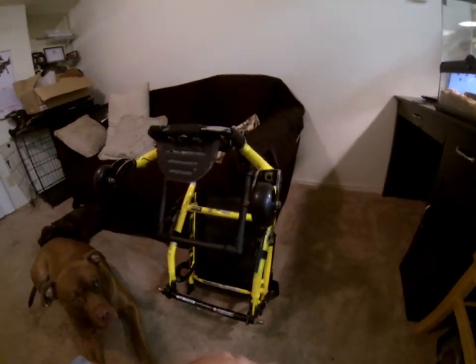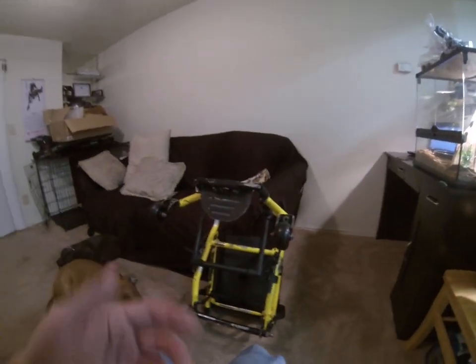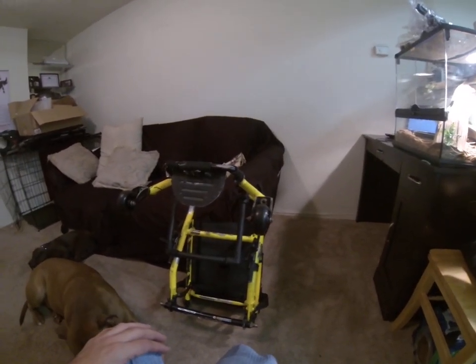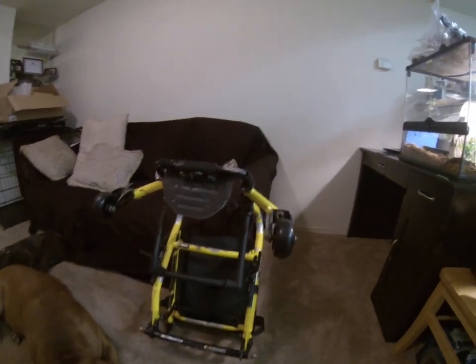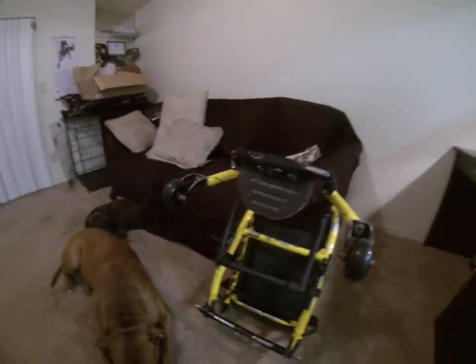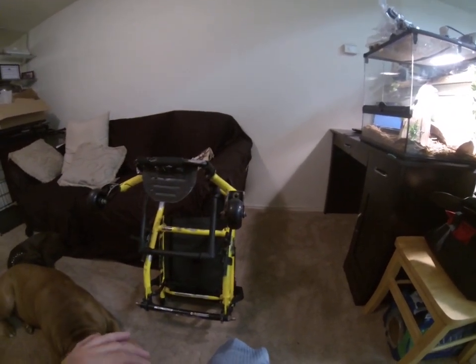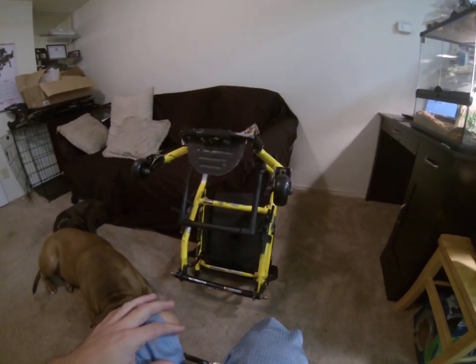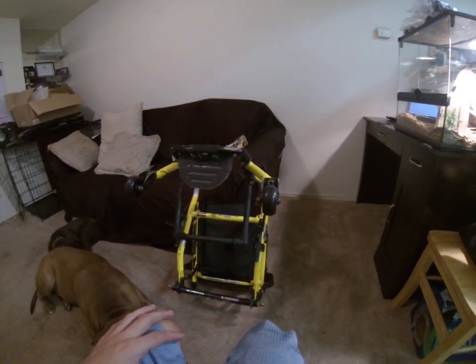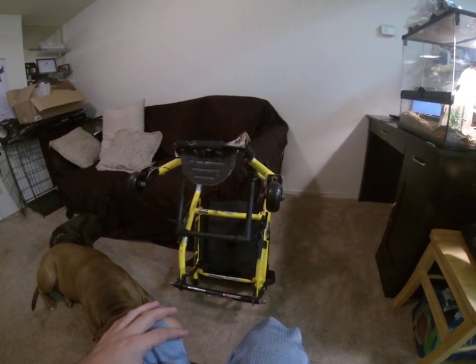Alright, so put the other one on there. I made another video, but for some reason it didn't record, so I had to just make this one right now. But yeah, I put the other one on there. It's the same process, and there you go. So it's got two little casters on there. I'm actually gonna donate this chair to a friend in the Philippines who doesn't have a pretty good chair, so hopefully this chair will do a lot better for him over there.